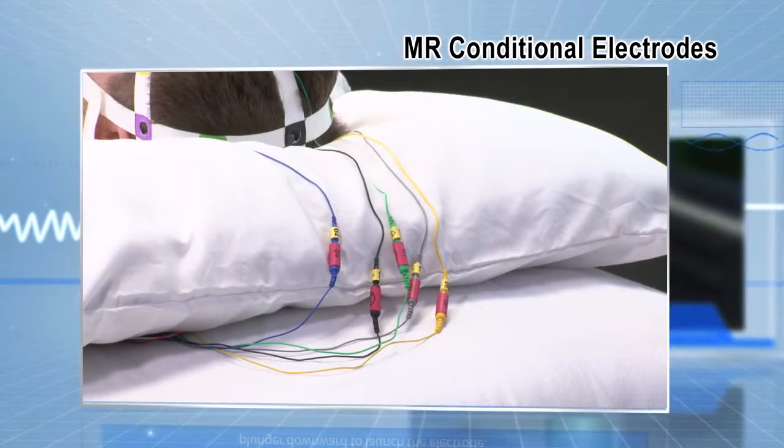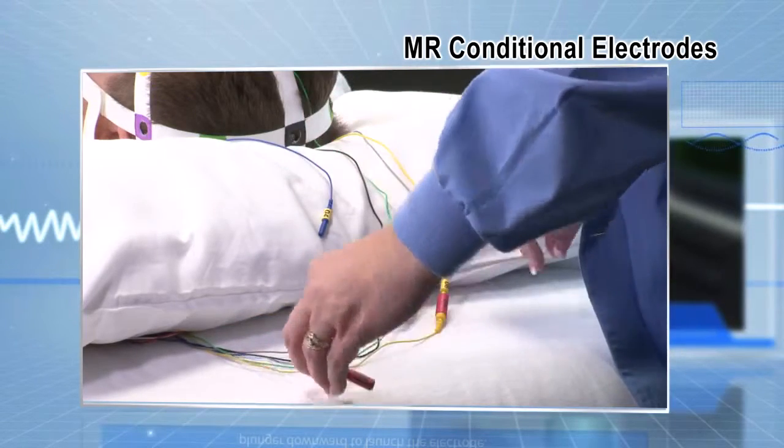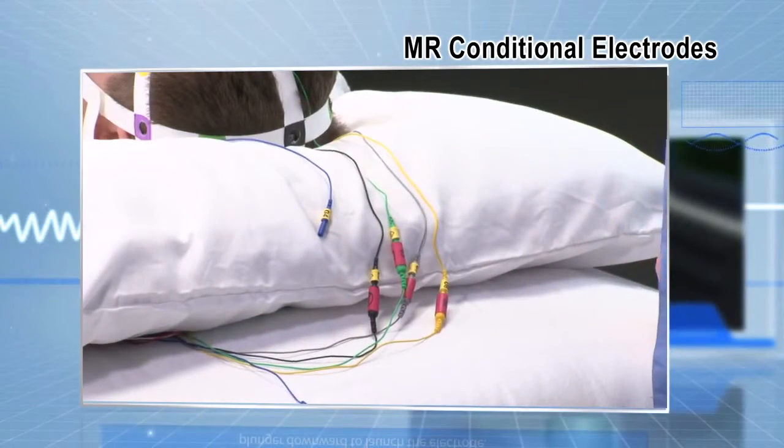When using RhythmLink MR Conditional electrodes, the side connected to the patient with the yellow band is MR Conditional and goes with the patient to the scanner. The side with the red band is MR Unsafe and stays at bedside.